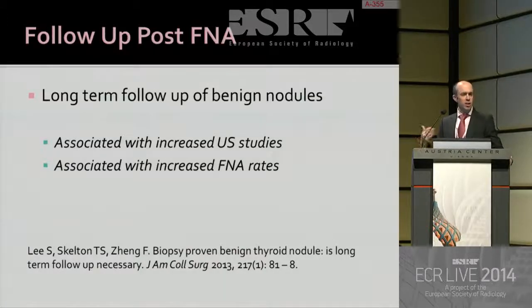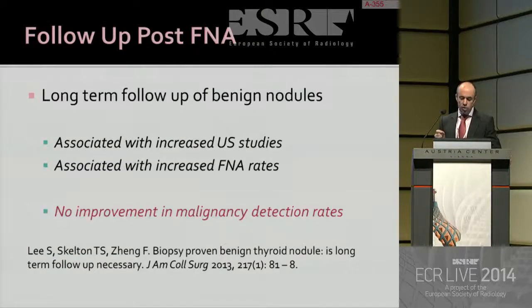Some people tend to continue to monitor and ultrasound thyroid nodules. Long-term follow-up, 3 to 5 years of thyroid nodules, has been associated with increased ultrasound studies and increased FNA rates, with no improvement in malignancy detection rates. So why do we continue to monitor these benign-appearing nodules?